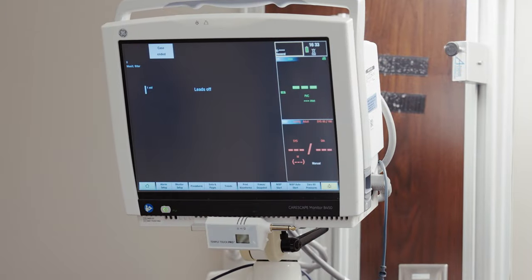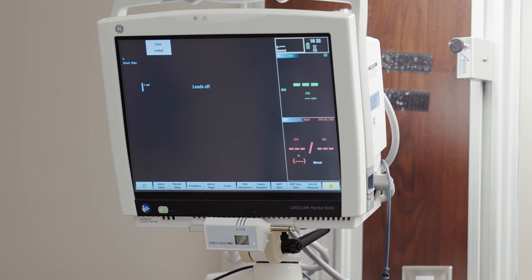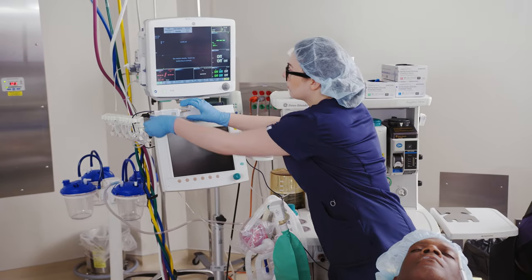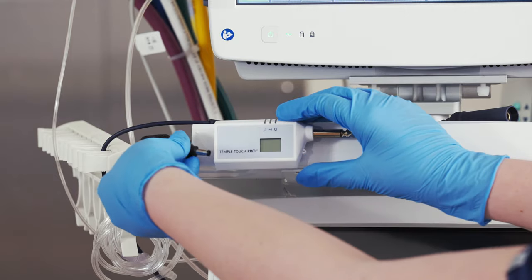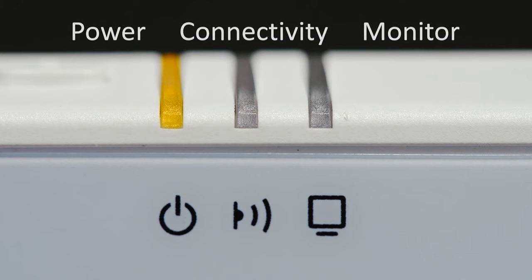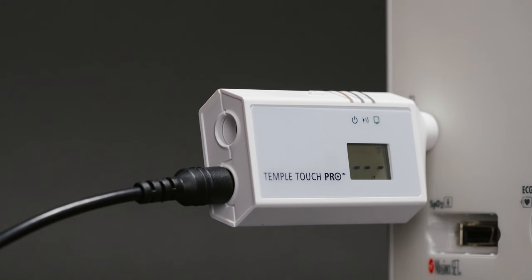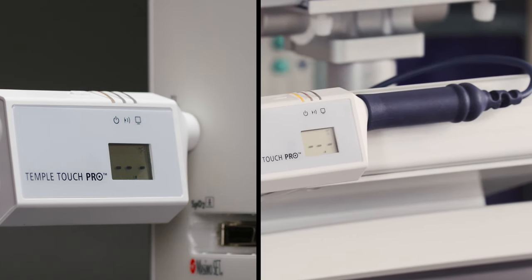Make sure the patient monitor is turned on and operating according to the manufacturer's instructions. Connect the power supply to the MCU — the display will appear in two seconds. The yellow MCU power LED indicates the MCU is properly connected to power. If connecting to a patient monitor, connect the MCU directly or via a DeRoyal interface cable.